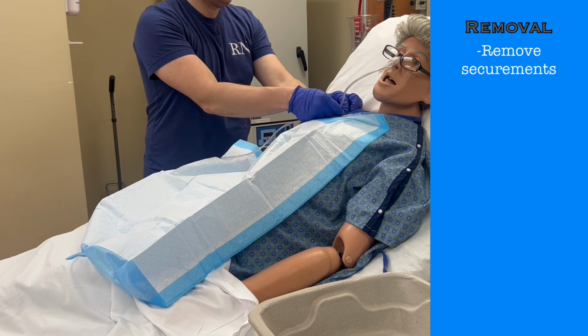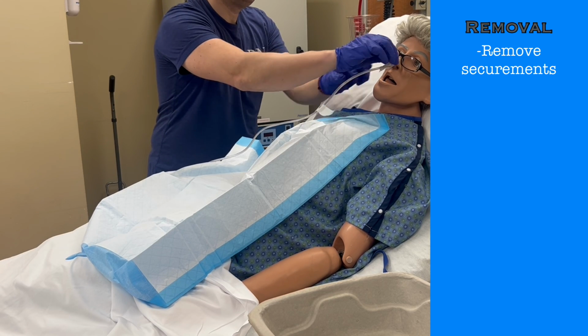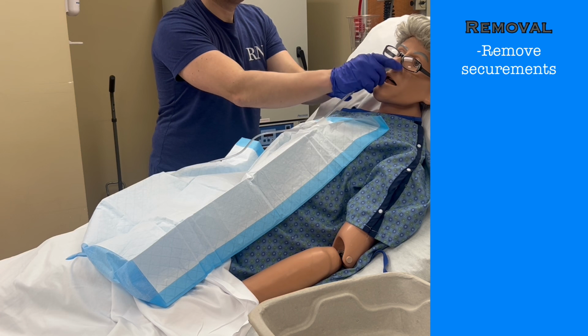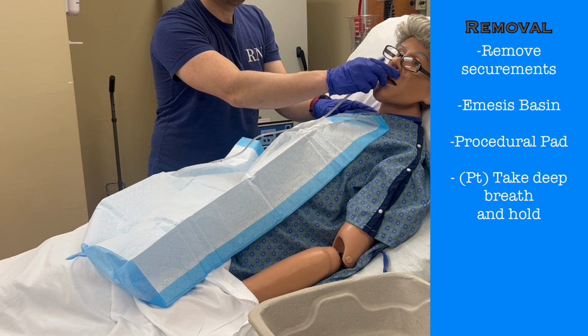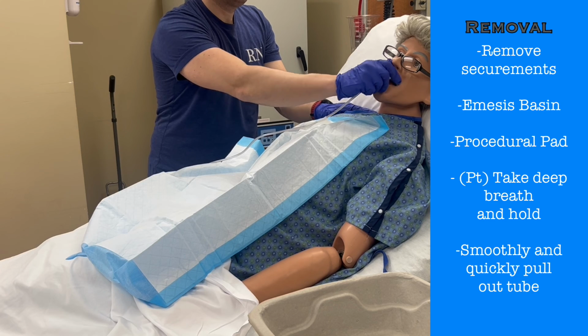Begin by removing the securement methods, the safety pin, and the Band-Aid or tape. Give the patient an emesis basin and put a procedure pad over their chest. Then have the patient take a deep breath and hold it. This closes the trachea and minimizes any risk of aspiration during removal. Then smoothly and quickly remove the tube.